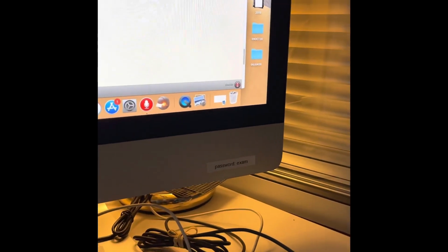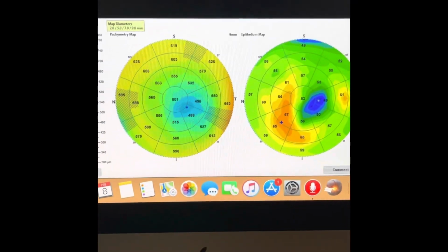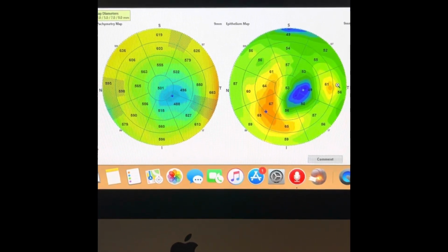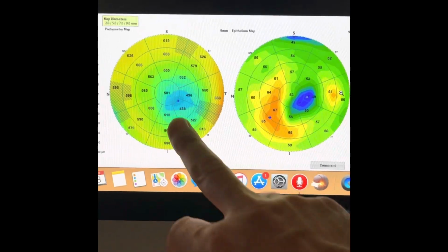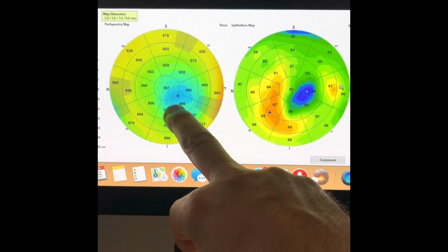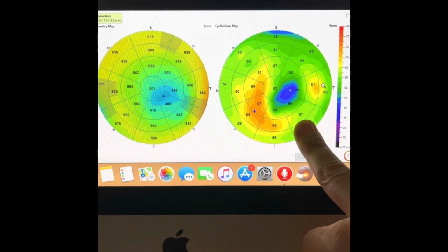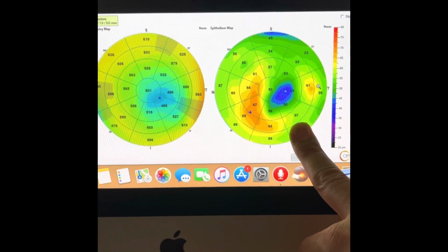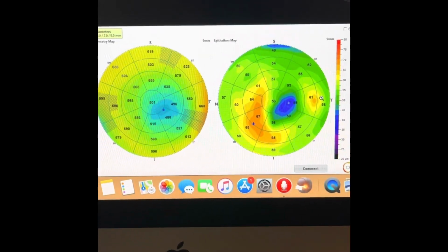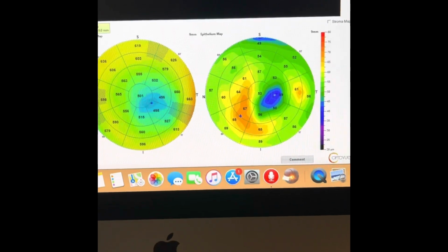It's great to share with you some of the highlights of taking care of a patient with the Athens protocol. Let's start with the images on the left eye of this gentleman who is past 40. So usually at an age that we expect keratoconus to be stable, we can see the cone here, thinnest cornea at 468. Just by looking at the epithelial maps on this patient late last year in 2020, we can see that the cone is active. He's complaining of deterioration in his vision, change in his refraction.